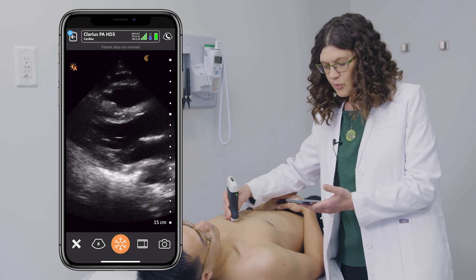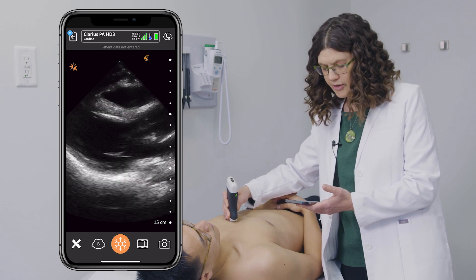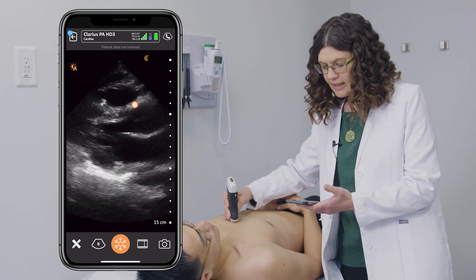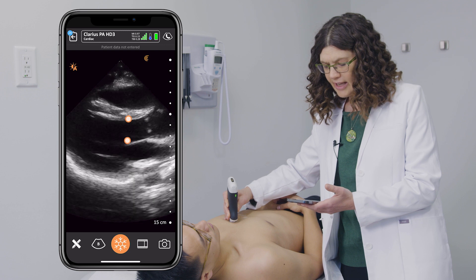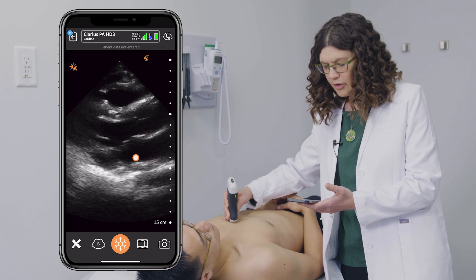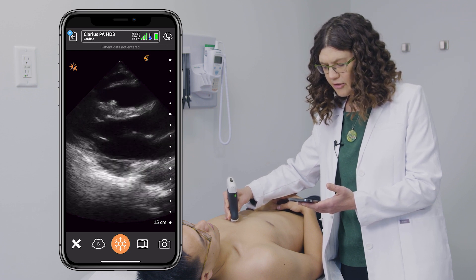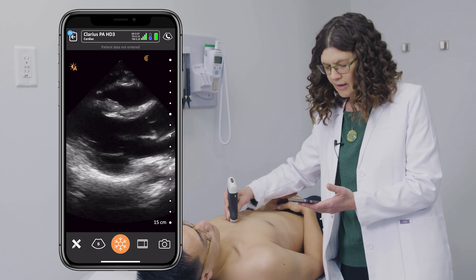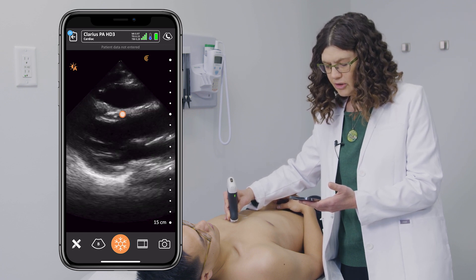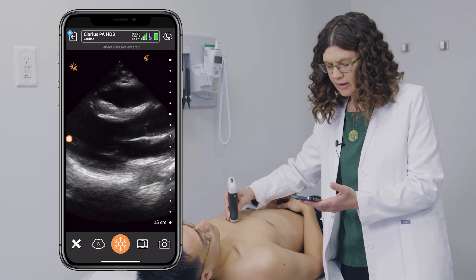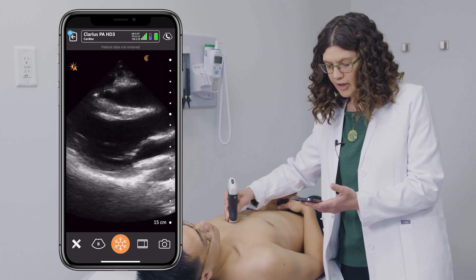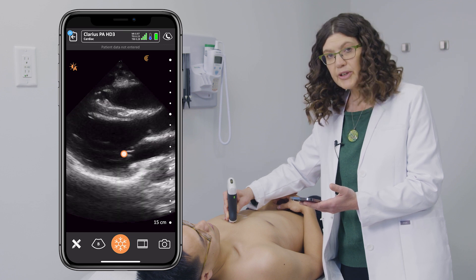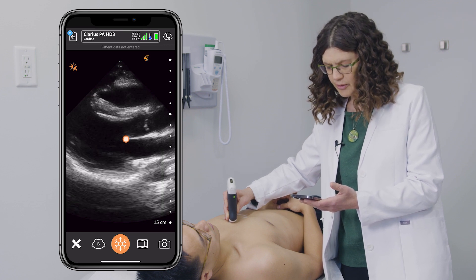On this very first window I have an excellent view of his heart. I can see the right ventricular outflow tract, I can see the aortic outflow tract and the left atrium. Looking at all three of these I can see that they're equal and so the rule of thirds is maintained. I can also see his left ventricle and see that it's contracting well. You get to see the aortic valve as well as the mitral valve and the anterior leaflet of the mitral valve hitting the septum.